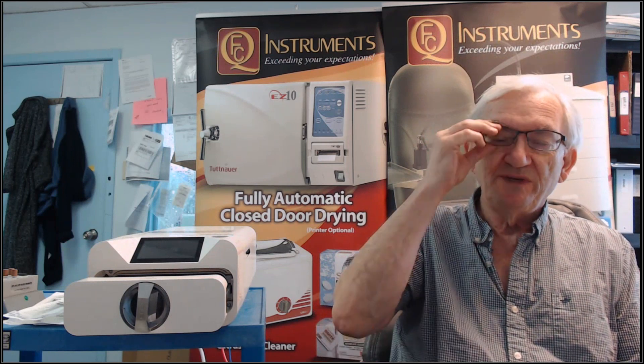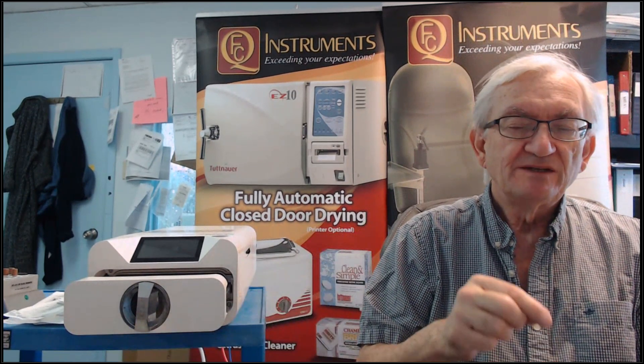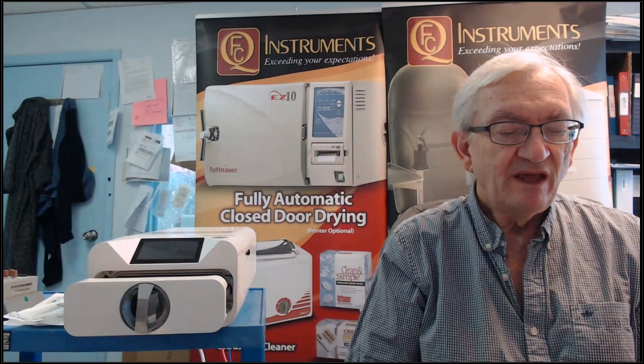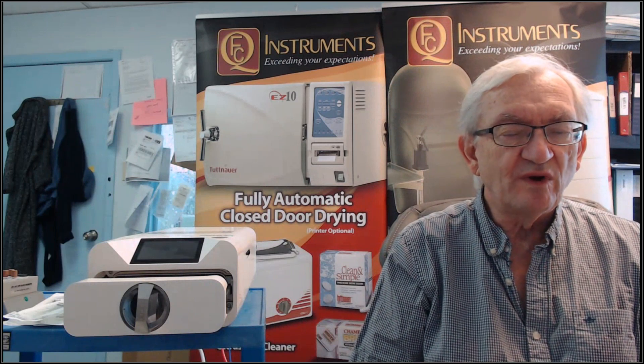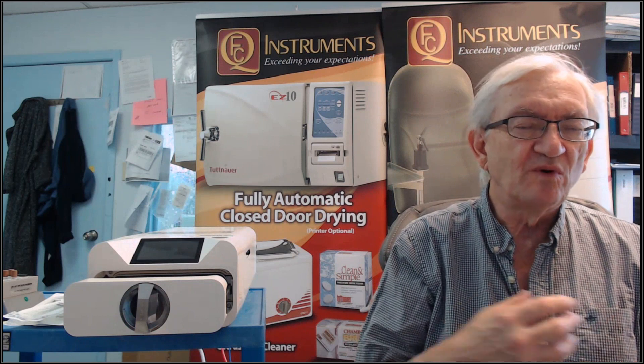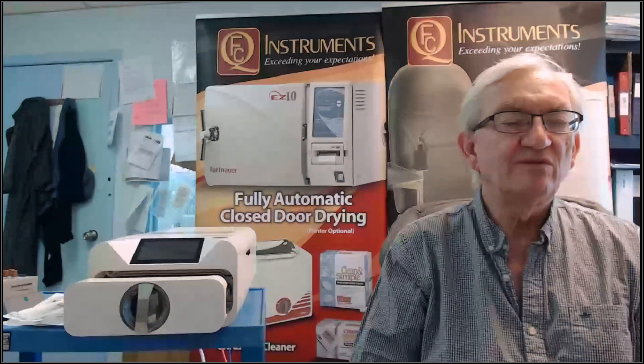It comes with a USB port, so all sorts of reports can be generated — all your cycle histories. It's a Class B sterilizer, and most Class B sterilizers are generally very expensive, typically running between $8,000 and $12,000. The only exception I'm aware of was the Tinga, which was a Chinese-made autoclave that really didn't have the support network needed to be a reliable alternative.